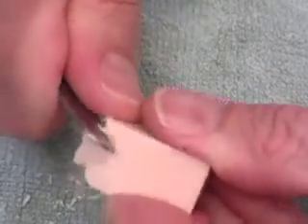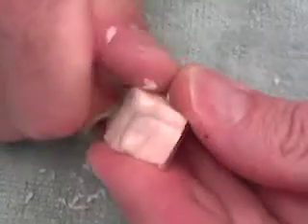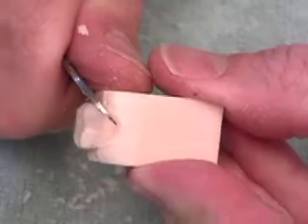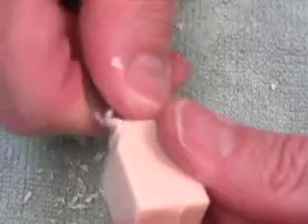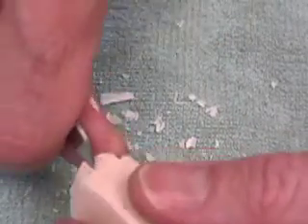I'll just reach in and round out these corners a little bit better so they're not hiding my tooth structure. So we're rounding across the facial side until we get down to the bottom third. And then on the lingual side, we're going to do the same thing.